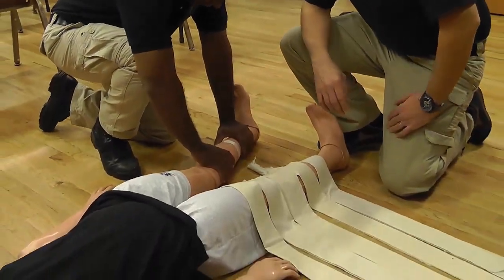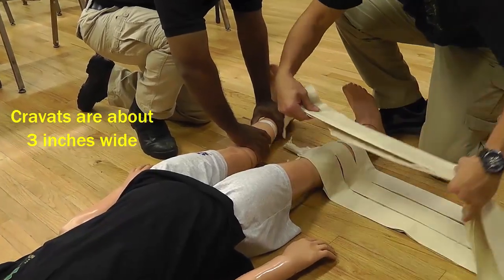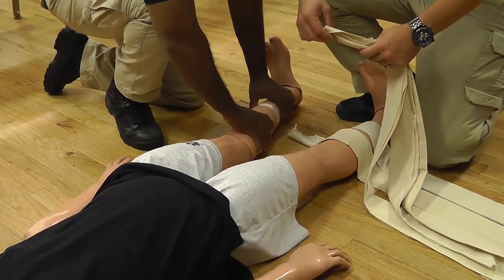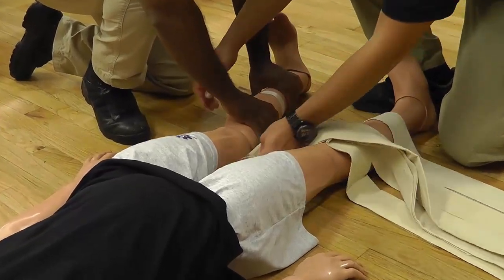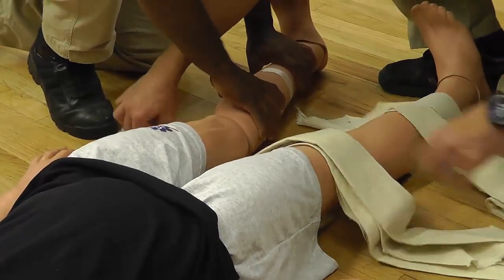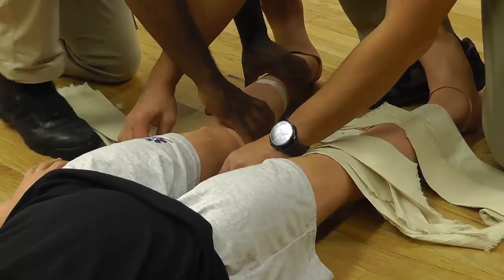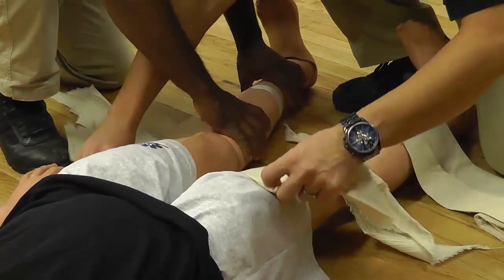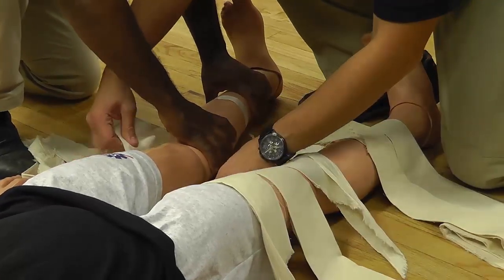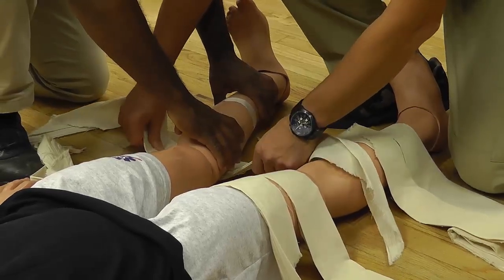I'm going to start off by taking three cravats and using the void you can find beneath the knee, I'm going to carefully slide the cravats under the patient's leg. I'm going to take two cravats and position them above the knee, and then I'm going to take one cravat and position it below the knee but above the fracture site.